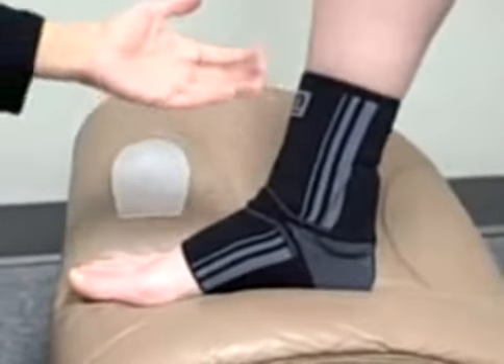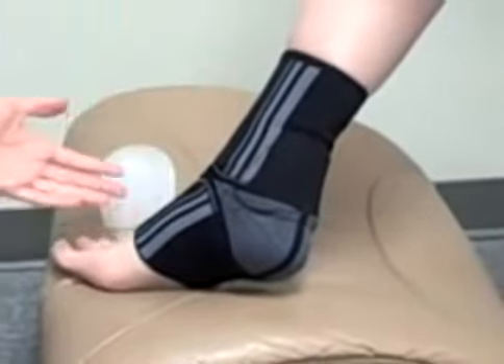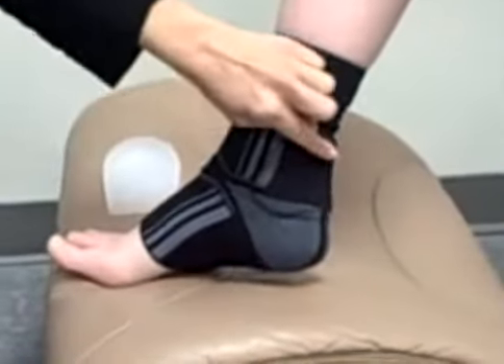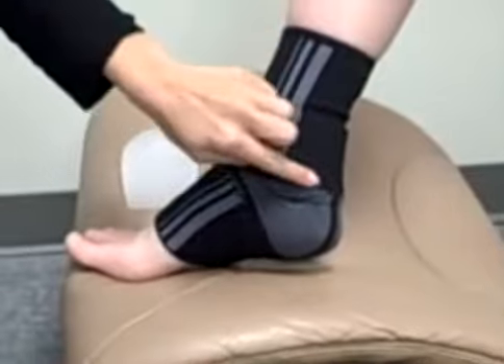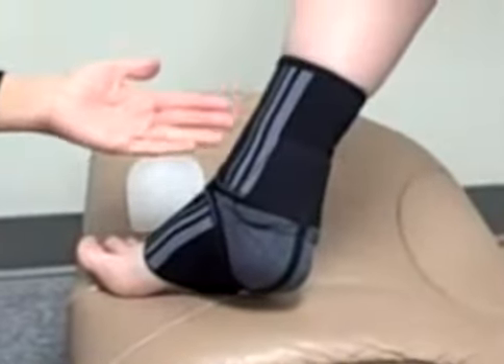Here we have our patient wearing the Medi Ocumed Achilles tendon support. This is a knitted brace. It has silicone padding in the back on both sides of the Achilles to give you support there where you need it.